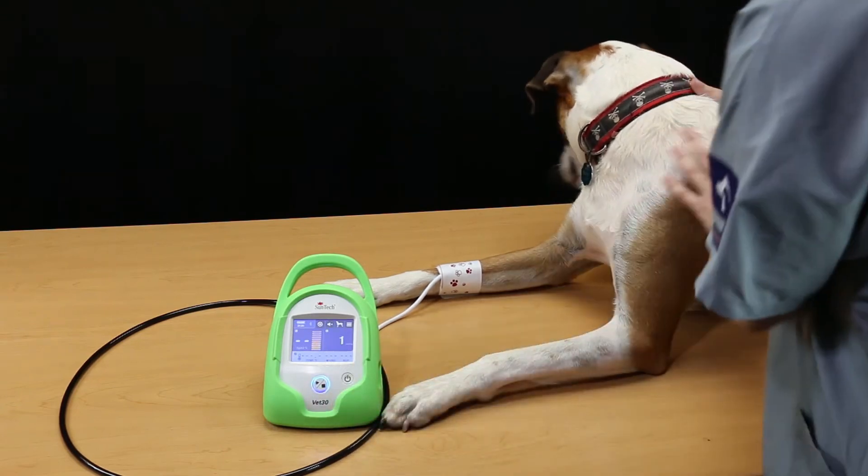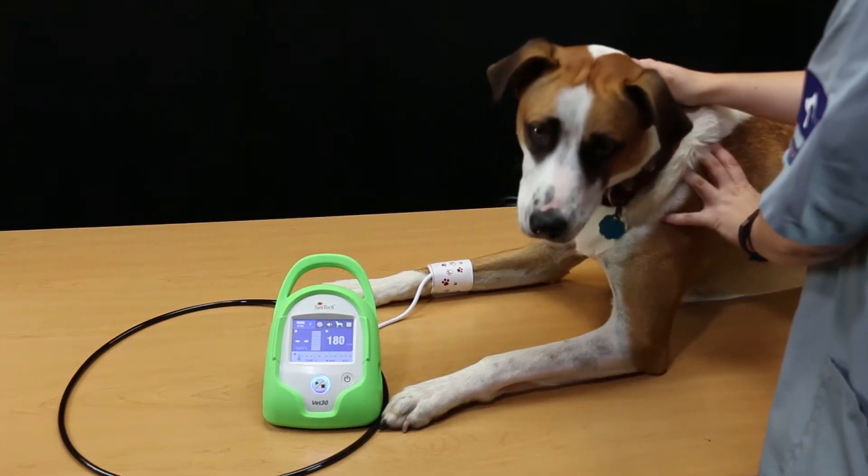To take a single BP measurement, hold the animal in place and press the Start button.